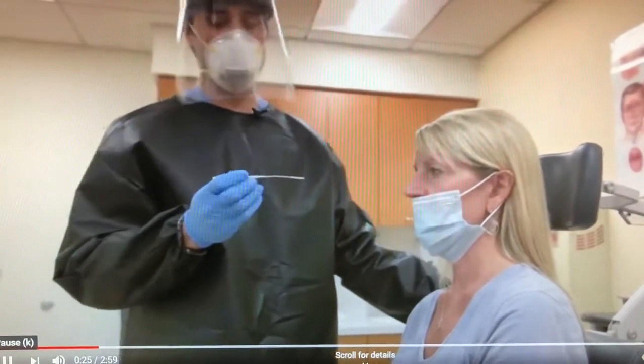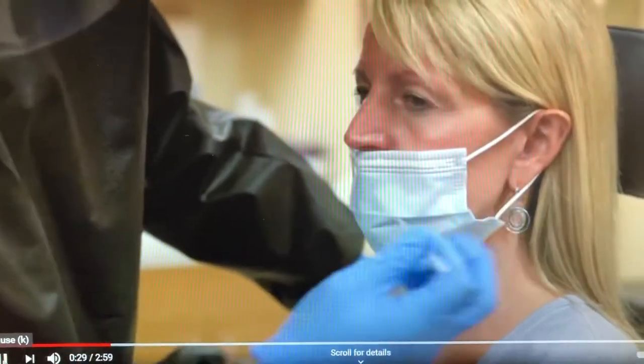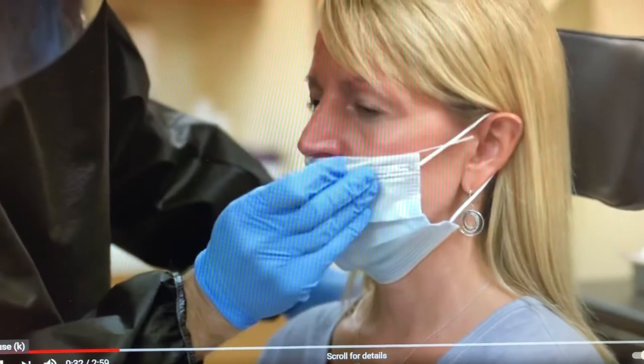To estimate the length of insertion to the nasopharynx, simply measure from the nasal ala. The ear canal is about seven to eight centimeters back from the nasal opening.